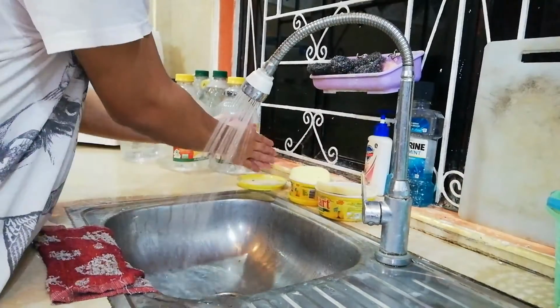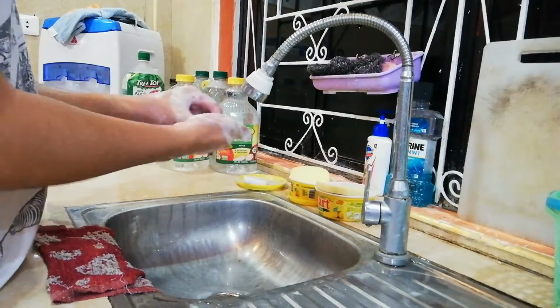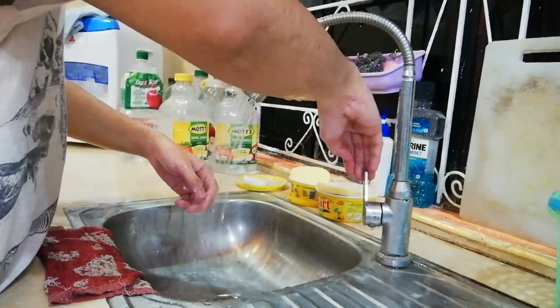A blood sample for ABG analysis may be drawn by percutaneous arterial puncture or from an arterial line. For the first procedure, do hand washing. It reduces the number of microorganisms residing on the surfaces of hands. Next is to read the doctor's order to obtain pertinent data.